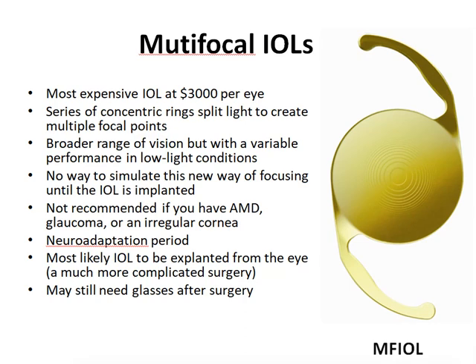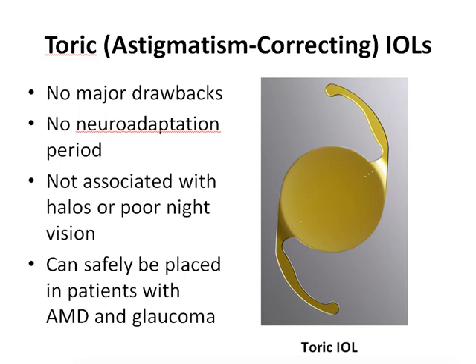A small percentage of patients are unable to adapt to their new vision and request to have this IOL exchanged from their eye. Complications during an IOL exchange are much higher than cataract surgery with primary IOL implantation. Multifocals may not be suitable for patients with macular degeneration, glaucoma, or irregular corneas. It's also important to note that many patients with multifocal IOLs still end up getting prescription glasses after surgery.